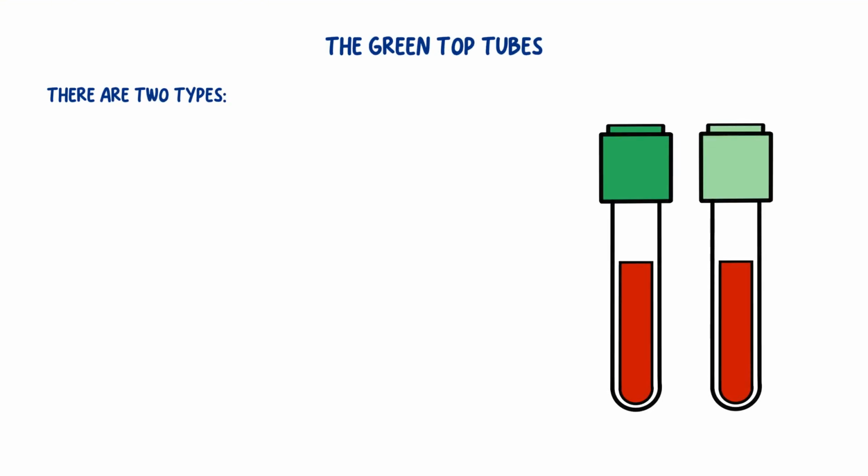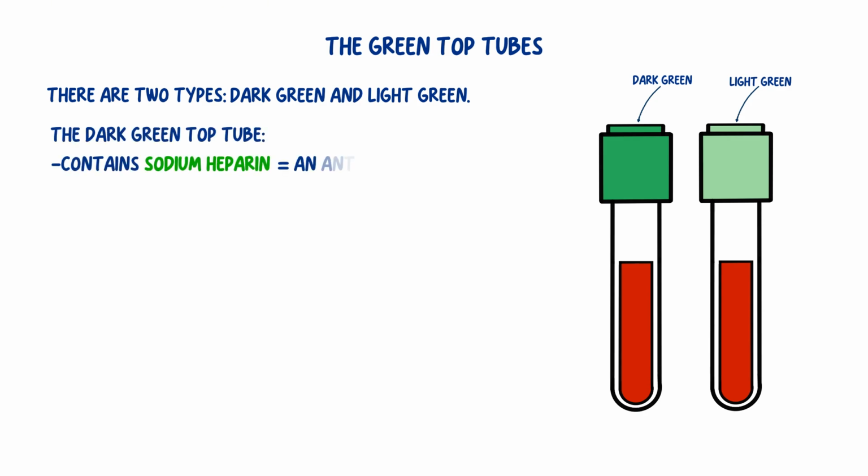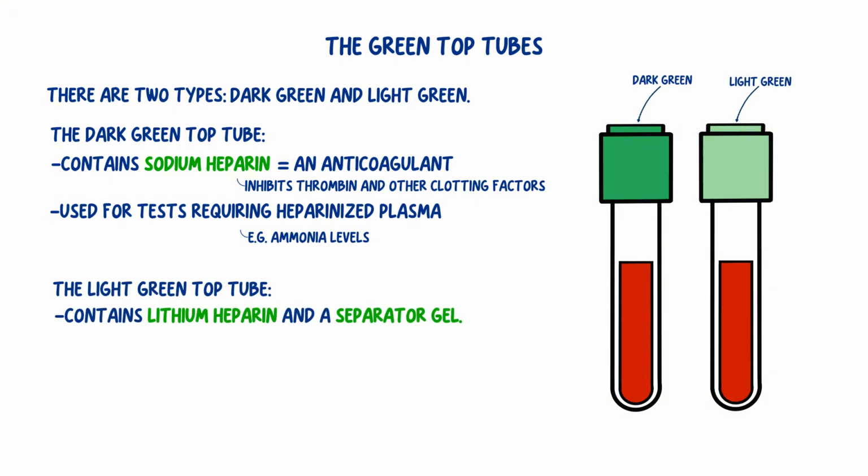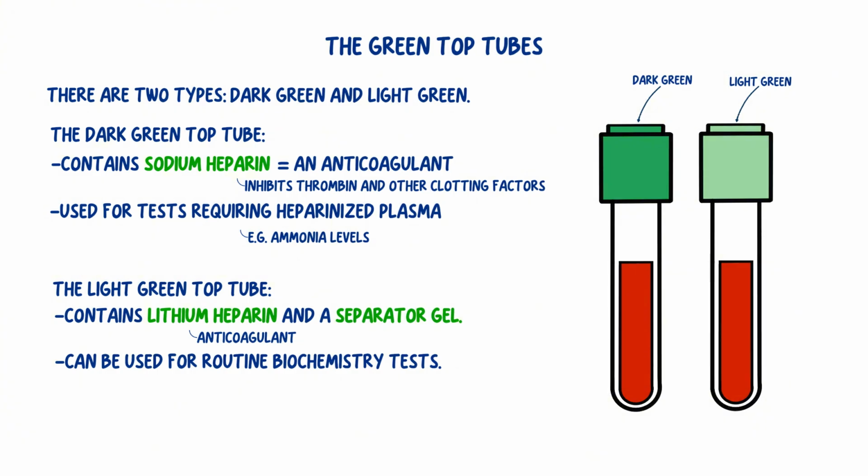Green top tubes are available in two types: dark green and light green. The dark green top tube contains sodium heparin, an anticoagulant that works by inhibiting thrombin and other clotting factors, preventing blood from clotting. This tube is often used for tests requiring heparinized plasma, such as assessing ammonia levels in the blood. The light green top tube contains lithium heparin with a separator gel. Lithium heparin also acts as an anticoagulant in a similar manner, preventing clot formation. The separator gel in the light green tube forms a barrier between the plasma and cells after centrifugation, making it suitable for routine biochemistry tests as an alternative to the gold top tube. Both types are essential for collecting and analyzing heparinized samples, with their specific additives catering to different testing needs.